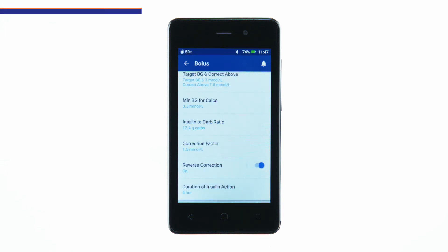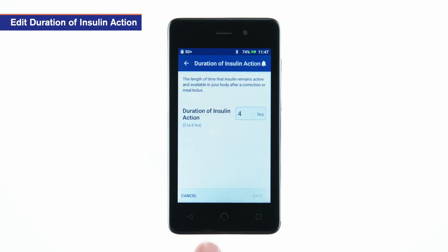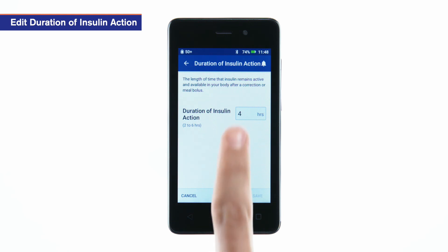To edit duration of insulin action, tap duration of insulin action. Enter the duration of insulin action.